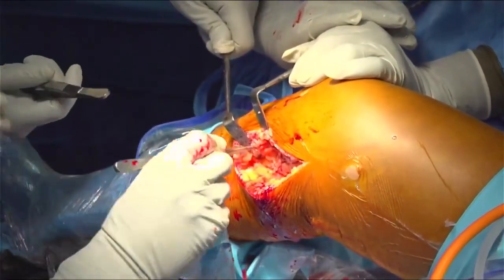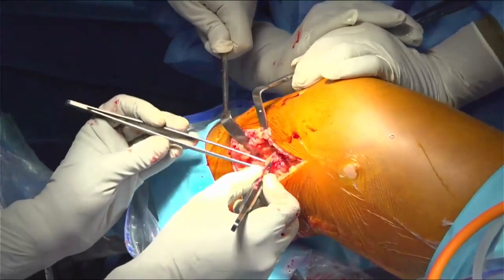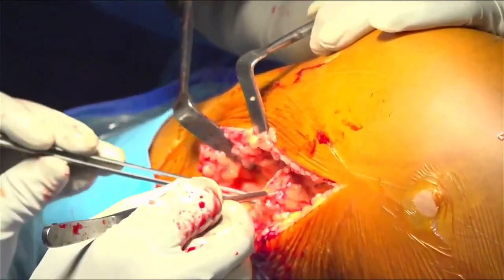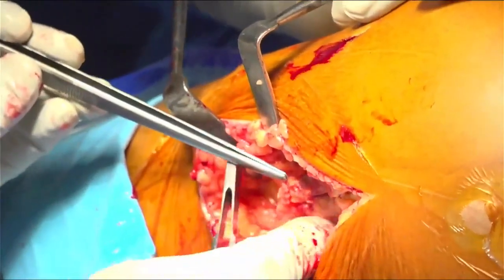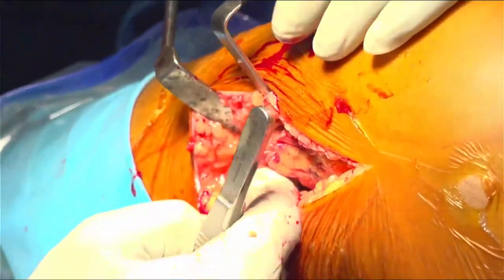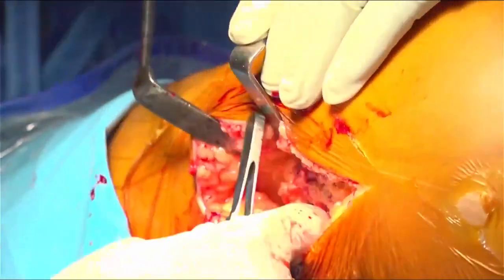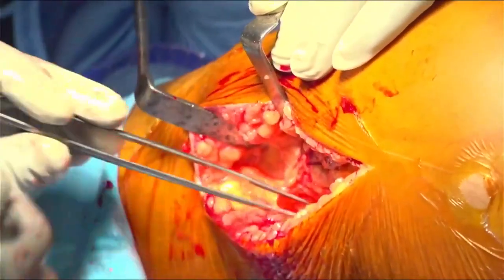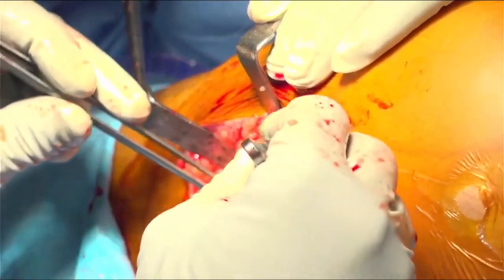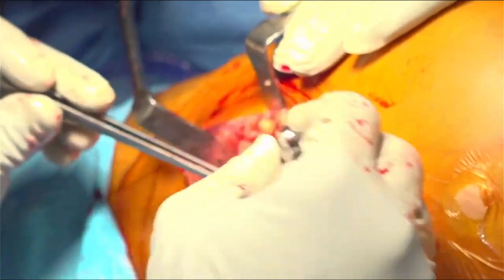So probably this is the region of my MCL, probably this one. I'll just make a little bit. So this is okay. So probably this is the area of the MCL which has been torn.